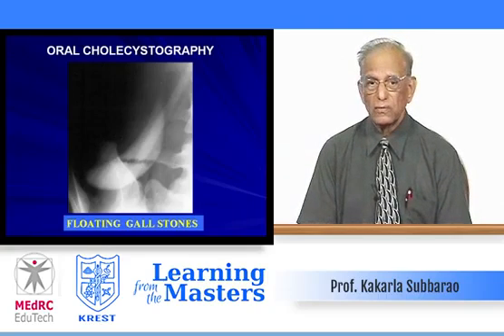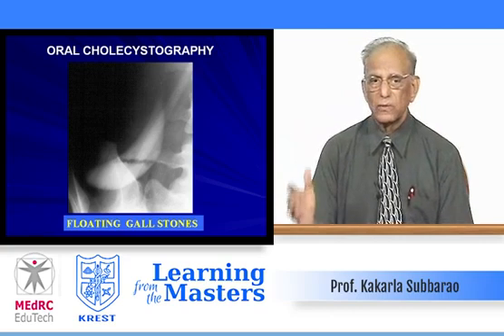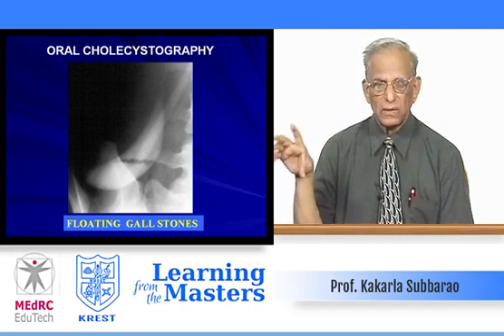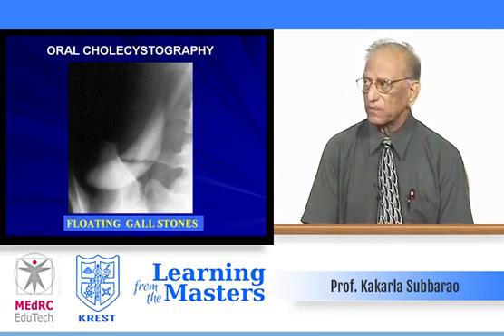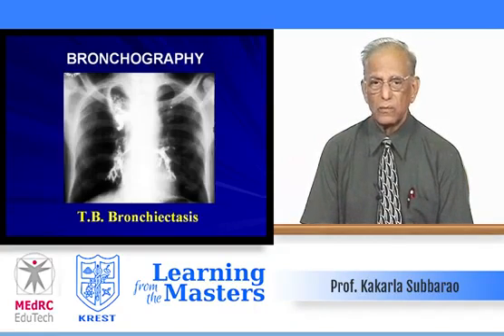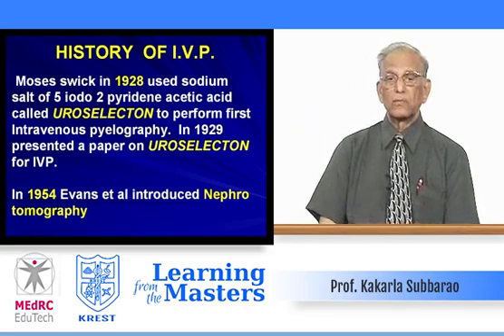Oral cholecystography, it is abandoned again, not necessary. Floating gallstones in the erect posture. These are the innovative methods that people have adopted, our ancestors. Bronchography to study the bronchiectasis, either localized or generalized. And then we come to history of IVP.